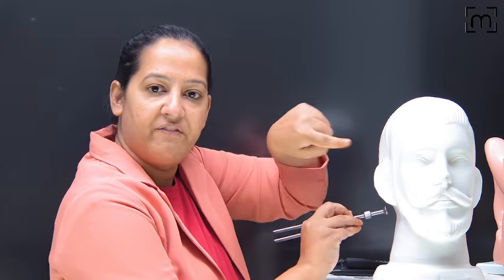Now coming to Schwabach's test. Okay, only one difference. Here we will not occlude the meatus, neither of the patient nor of the examiner. I will activate the tuning fork and keep it on the mastoid directly without blocking the tragus. Here again I will activate the tuning fork and keep it on my mastoid without blocking the tragus. You're getting it? So here the background noise is not blocked.